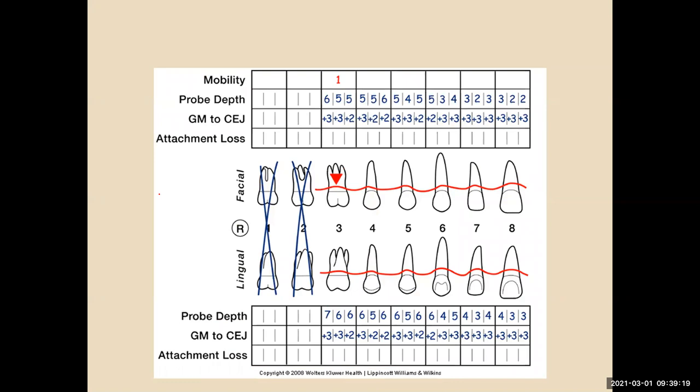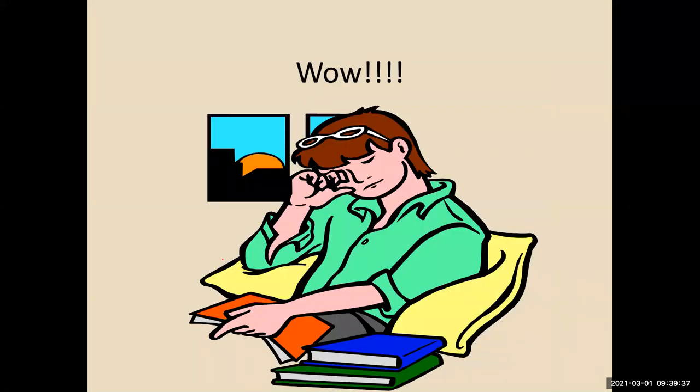So you're looking at your perio. You've got gingival recession, so you know you've got a lot of root surfaces. You've got furcations. This is where you would be using your slim lines and your lefts and your rights for the pocket depth. Okay, that's it.